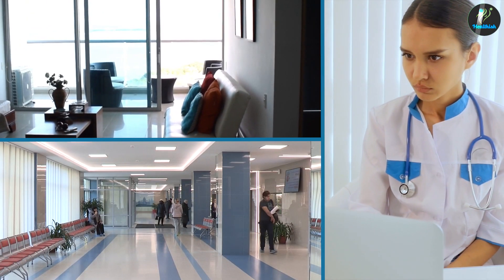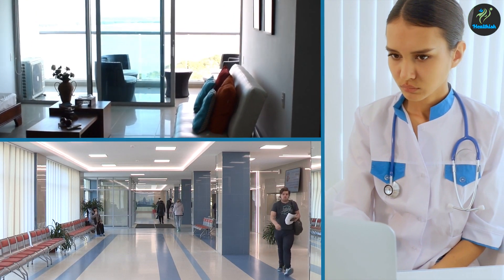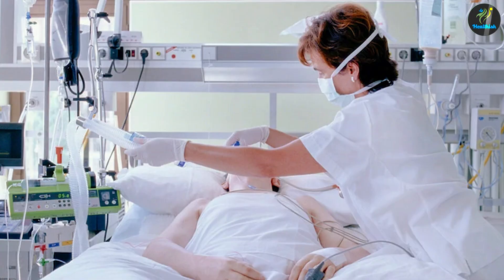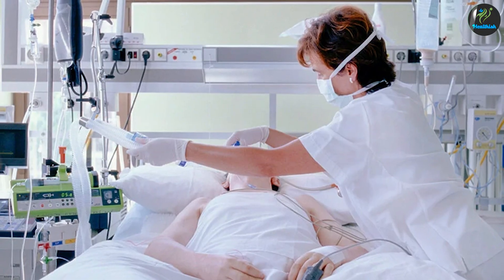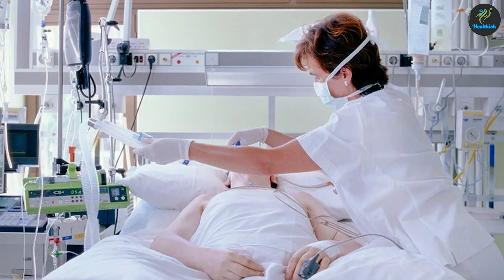The device is commonly used in hospitals, clinics, and even at home to monitor the vital signs of patients with respiratory or cardiac conditions.